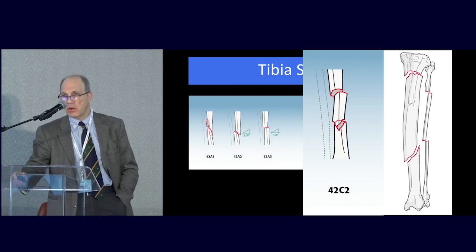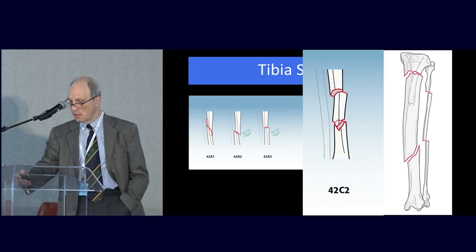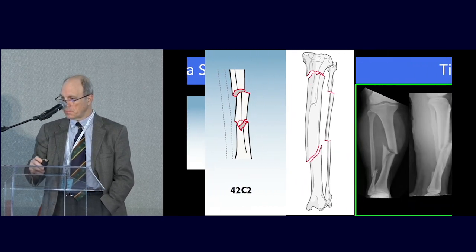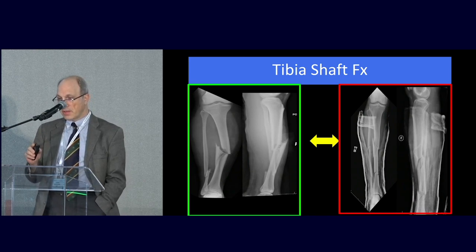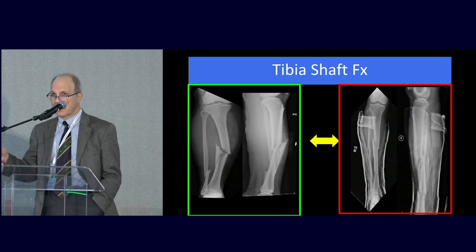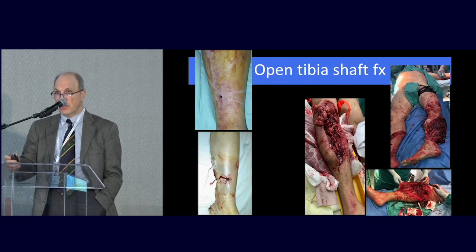Then you're going to have more trouble holding your reduction or the fixation, and you're going to need to use a lot of techniques that Dr. Kretek already mentioned. As I'm going to reiterate again, they are different. They're not only different on X-ray, because there are two separate fracture lines, but they also have soft tissue concerns, right?